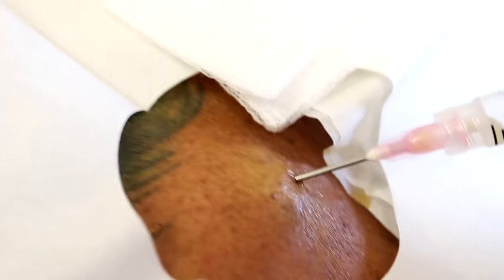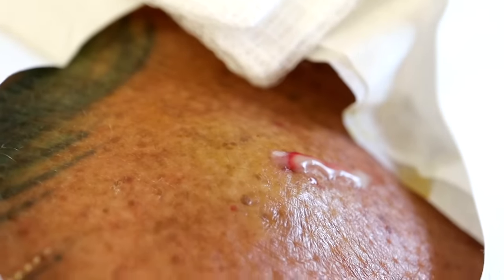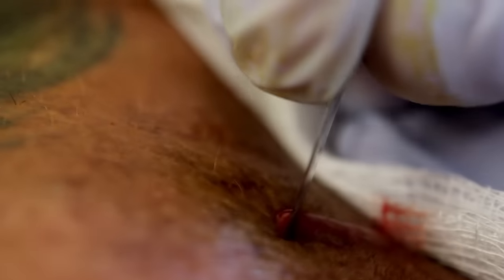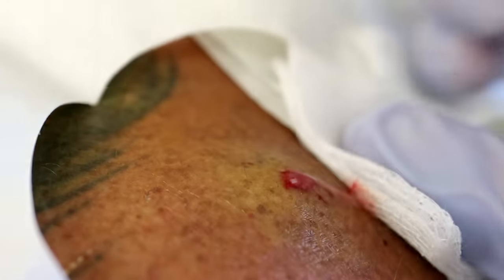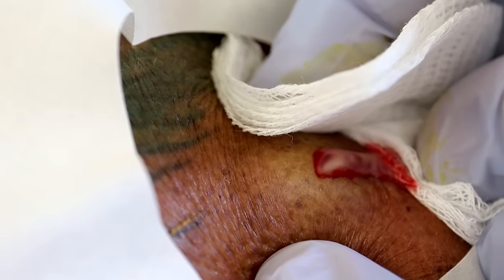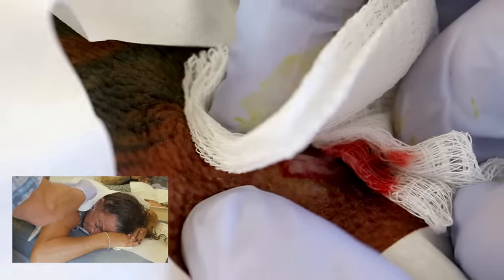Create a hole and squish it out. We've got a little bit of pus in there — you can just see it, it's thick. So we're going to get our number 11 blade. Oh, there is pus oozing out of there. We'll slice into that. You okay still? Oh yeah. No pain? Nope. Perfect. Oh, there — you see pus coming out. A flowing river of pus. Yuck. More.